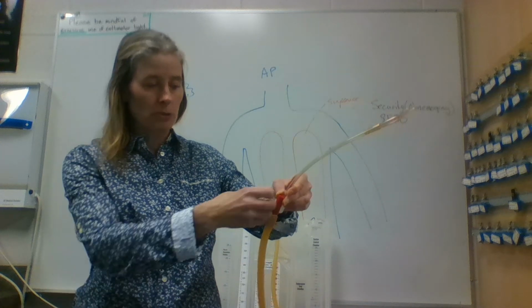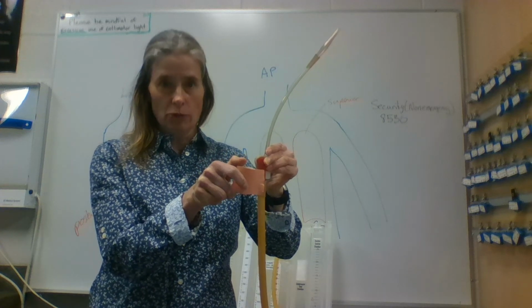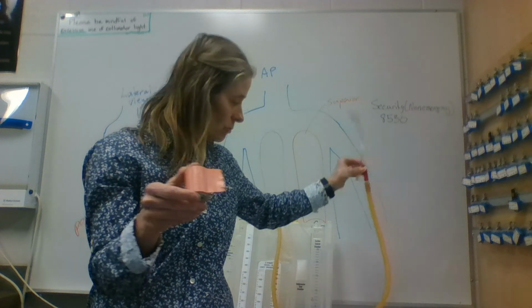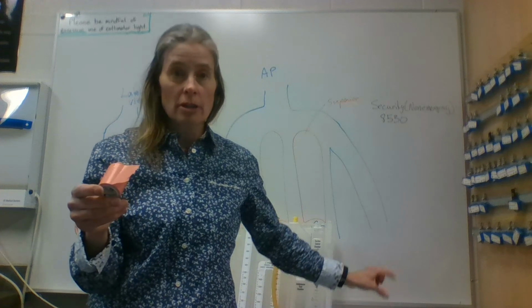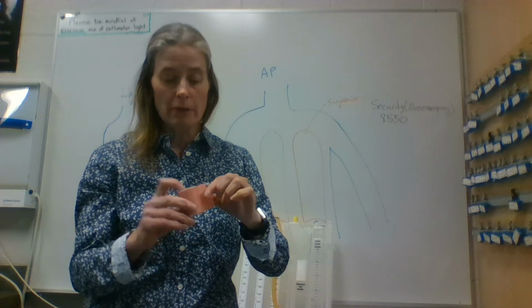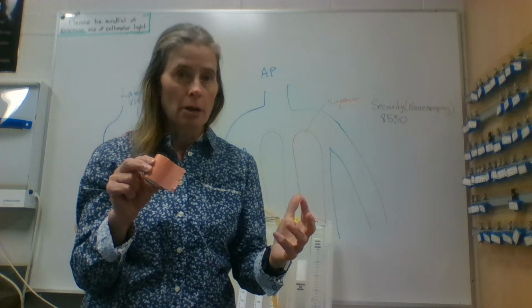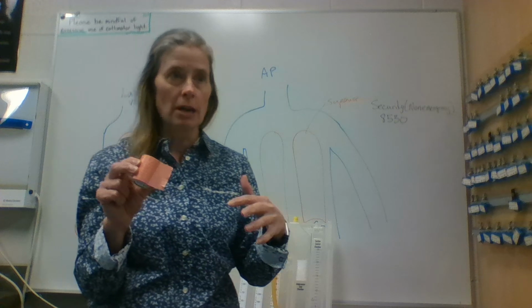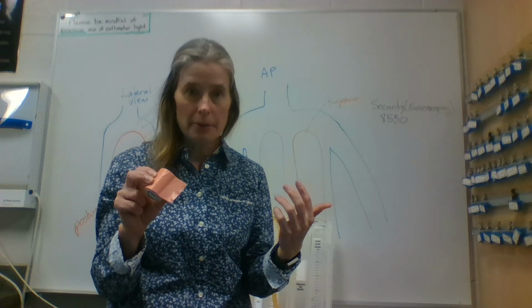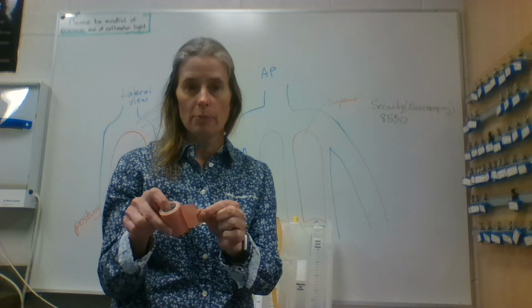This is also the tape that is used to secure the chest tube to the patient's chest, to the skin as well. So whenever you see this, chances are there's an indication that there's fluid around. It could also be used when a urinary catheter is used. So this flesh-colored tape is considered the waterproof tape.